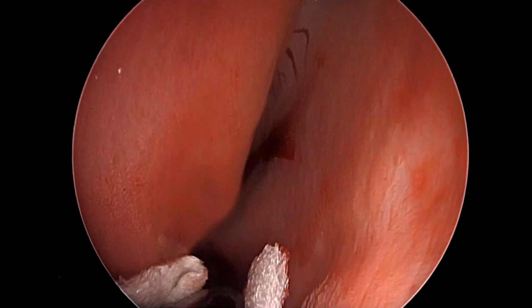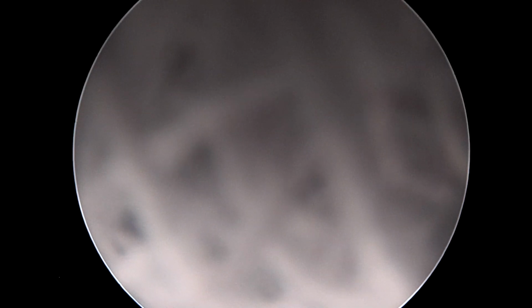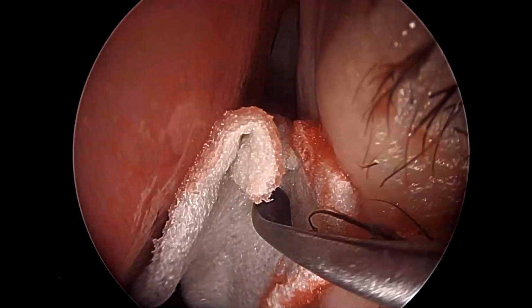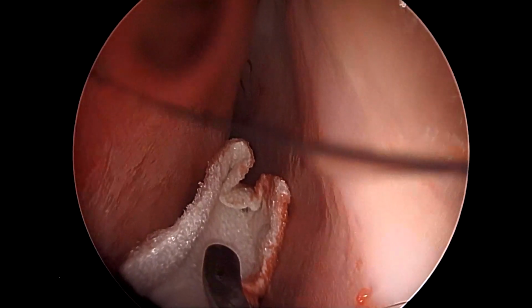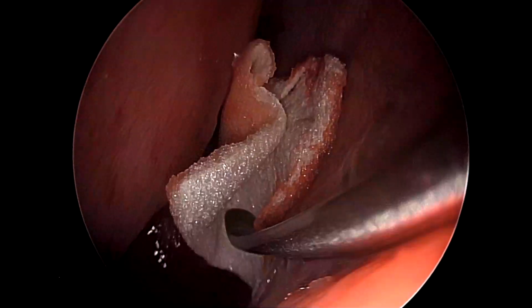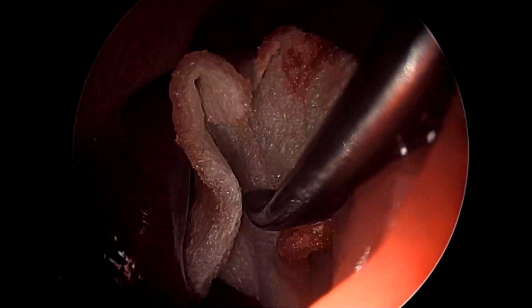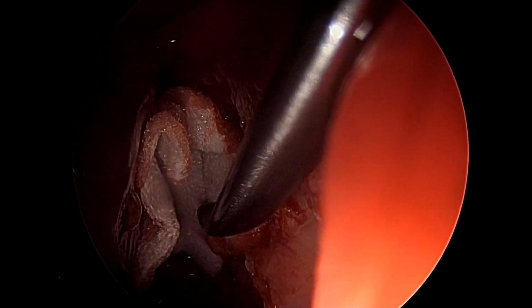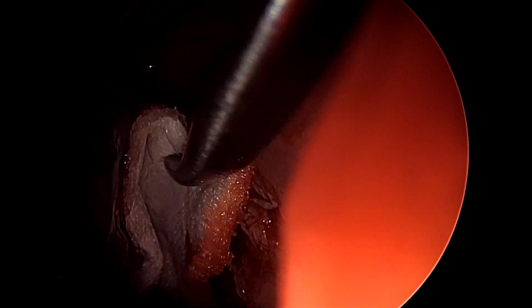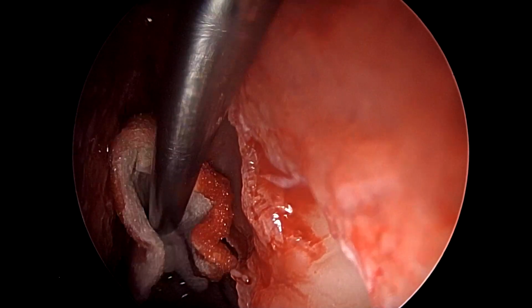Here we use compressed pieces of long gel foam strips. We do not prefer to use small gel foam fragments the way we use in tympanoplasty. Here we want to use longish films which can cover the entire defect and much more area of reconstruction from bone to bone, so that it helps in immobilizing our graft assembly. So once again, rather than using any Blakesley forceps that tends to pull them back, here we use the same curved, broad blunt elevators to create a layer of gel foam over it.